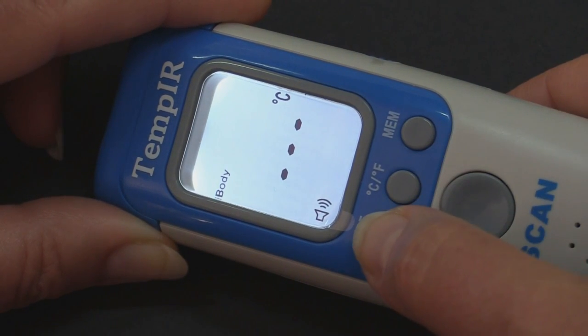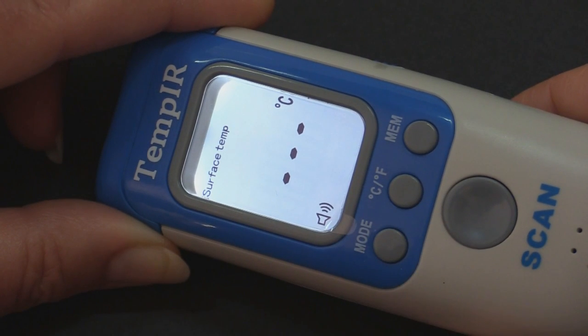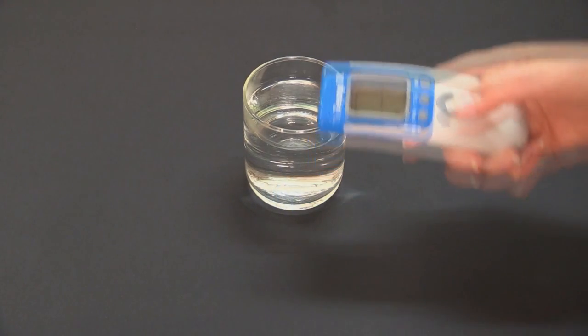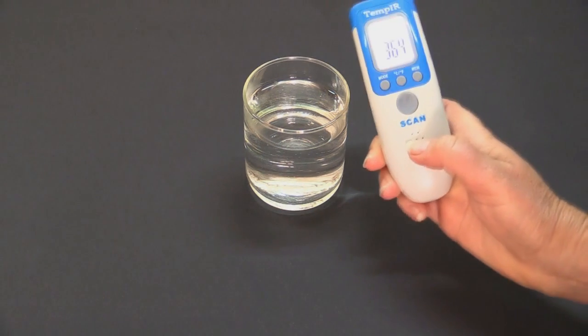Then press the mode button to select surface temp. Here we are going to measure the temperature of a glass of water. Hold the unit 2cm above the water and press the scan button for about a second to take a reading.